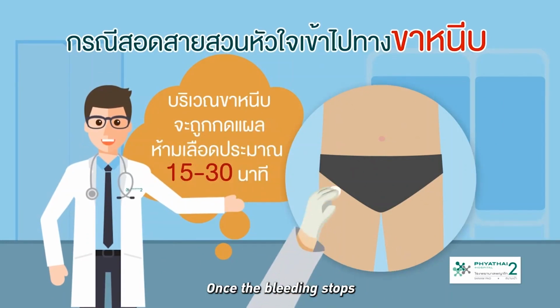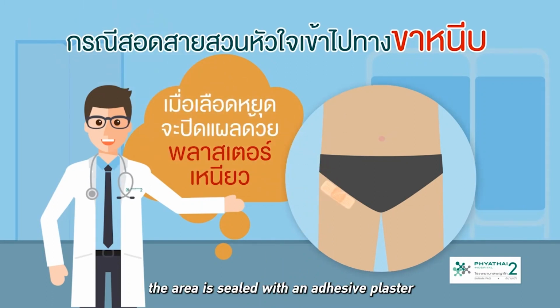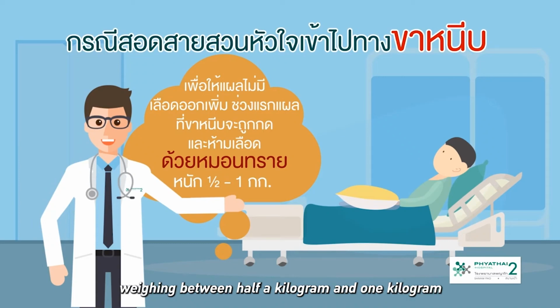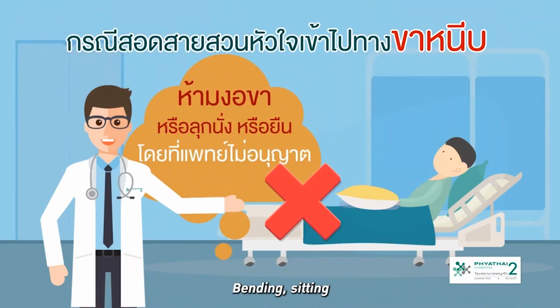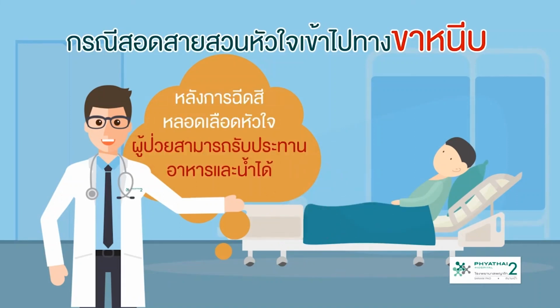Once the bleeding stops, the area is sealed with an adhesive plaster, and initially, to prevent further bleeding, the groin area is compressed and restricted with a sandbag weighing between half a kilogram and 1 kilogram. Bending, sitting, or standing without a doctor's permission is prohibited. After coronary angiography, patients can eat and drink.